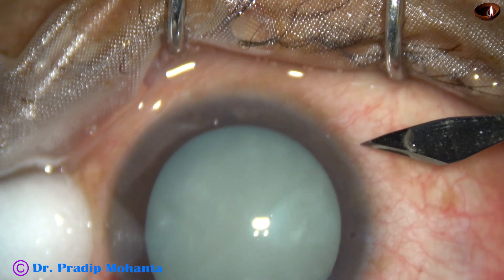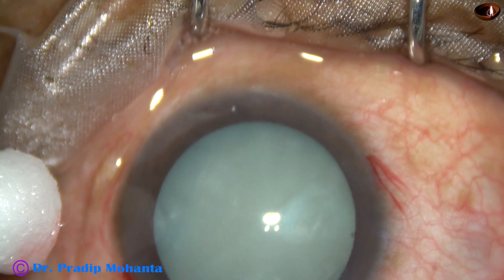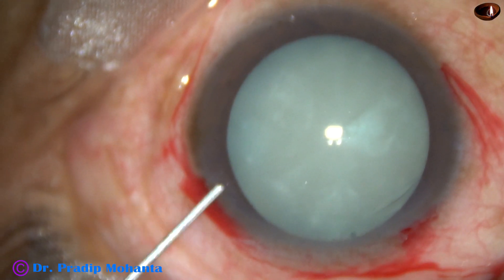And this is another side port on the right side of the main incision, about the same distance away. The patient is under topical anesthesia. Most of the surgery is unedited.